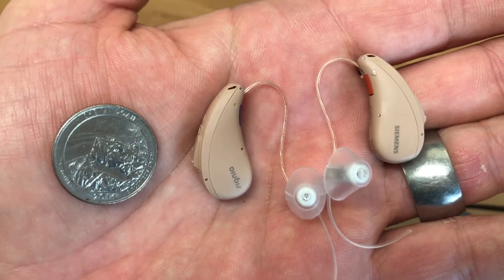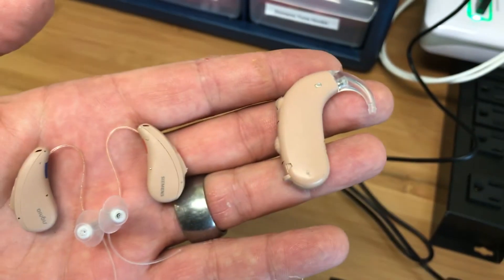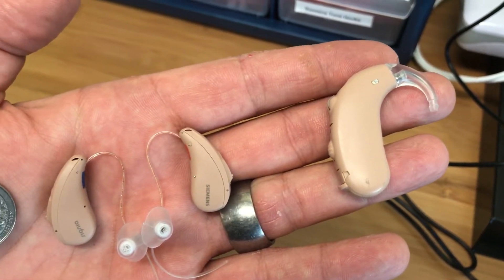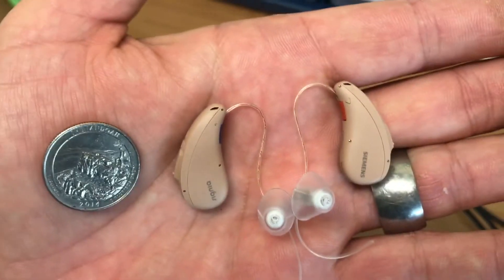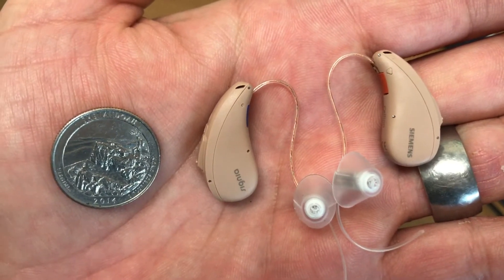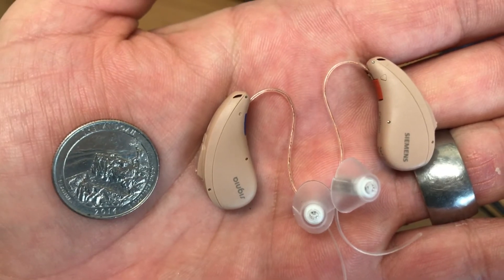Most people when they're first getting hearing aids are worried about the size. They're worried about getting something like that — the kind of thing you see behind somebody's ear and think, oh no, I don't want a pair of hearing aids like that. Well, most hearing aids are not like that. Most hearing aids are like these — very small. So when they're on your ear, most people are never going to see them; they'll just notice that you hear better.